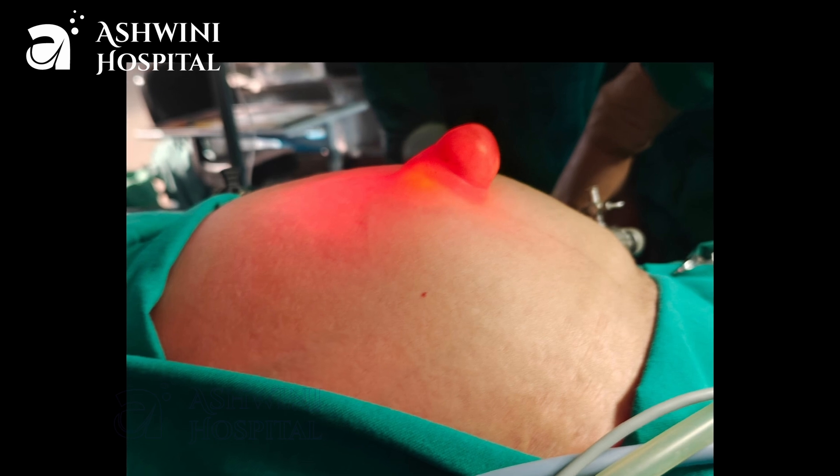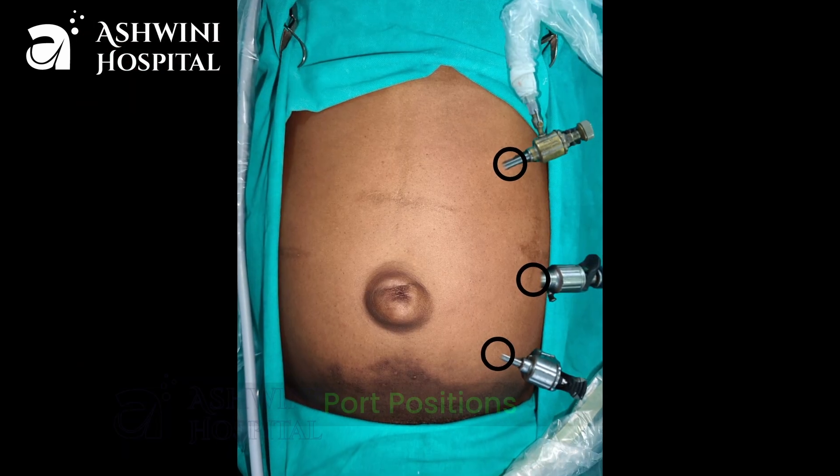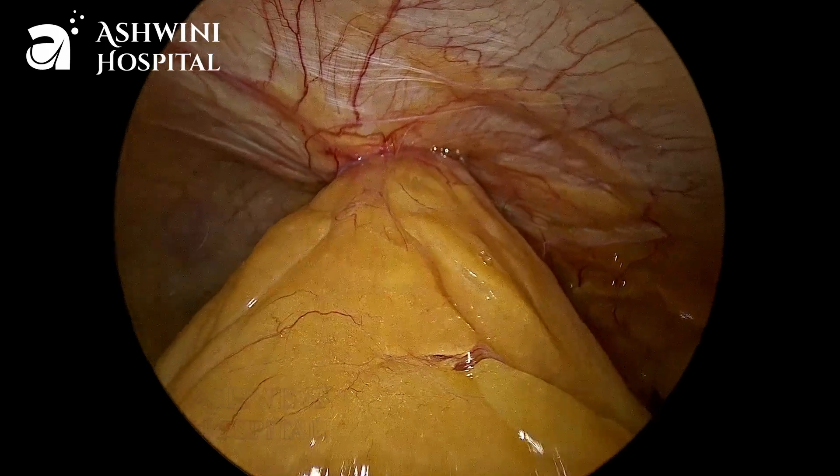This is the umbilical hernia. We use lateral ports — one 10 mm and two 5 mm ports. We can see the omentum herniating into the umbilical hernia.